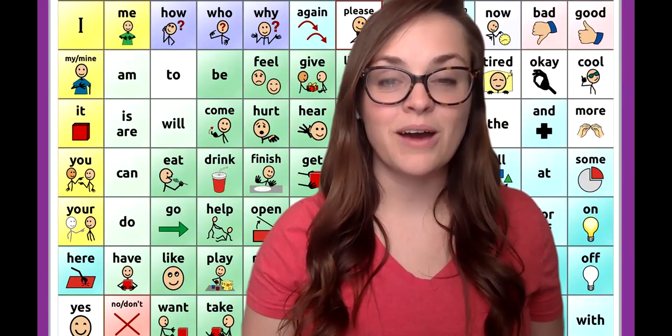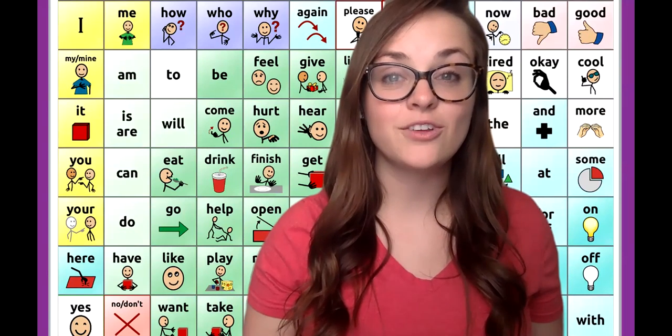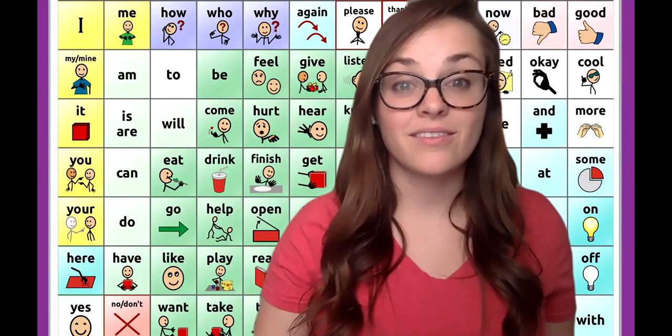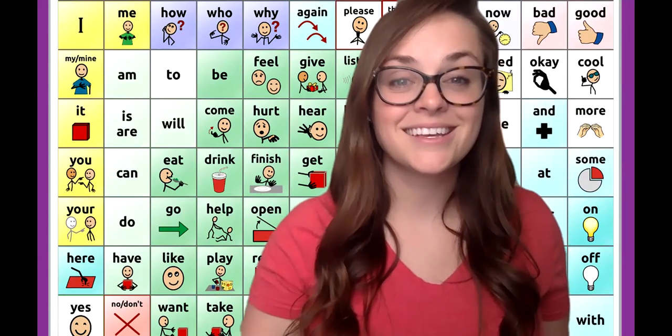Hi, today I'm going to show you how I model for clients who use TouchChat and NOVAChat on teletherapy via Zoom. Behind me, you'll see a virtual background that I really didn't have to do any work to use.